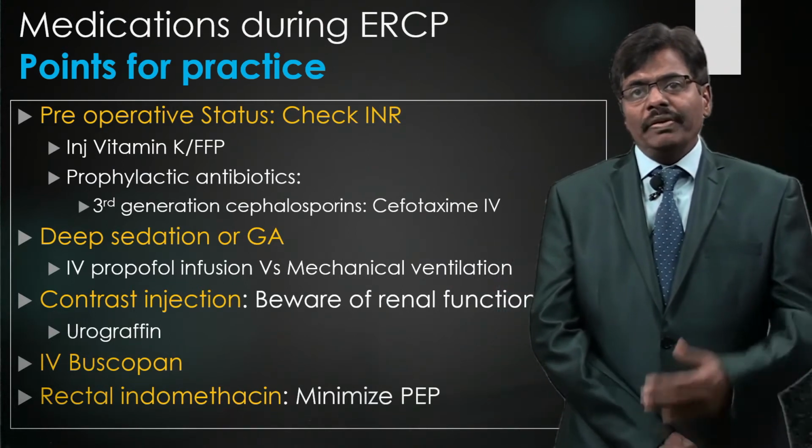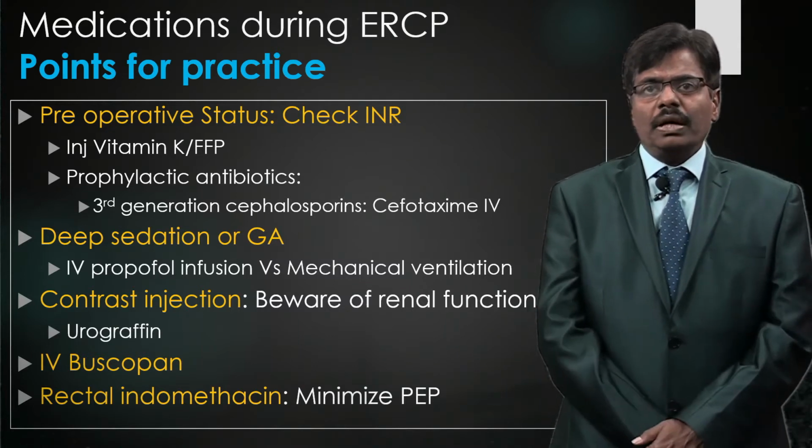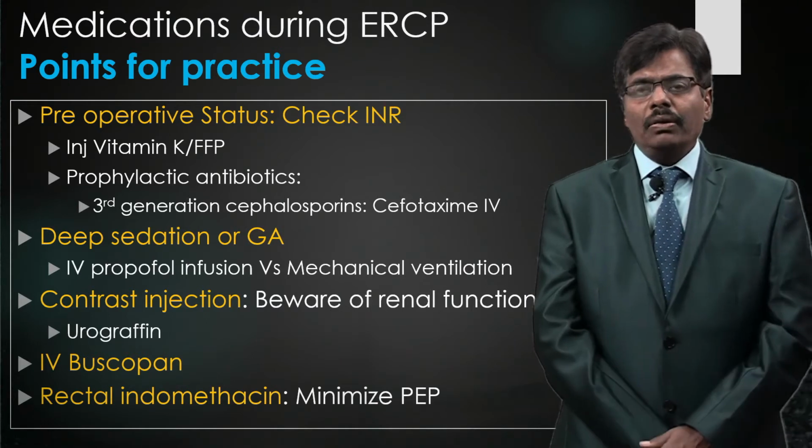Some people do without giving the patient Buscopan. 20 milligram Buscopan at the right time keeps the duodenum immobile, and ampullary cannulation is better.